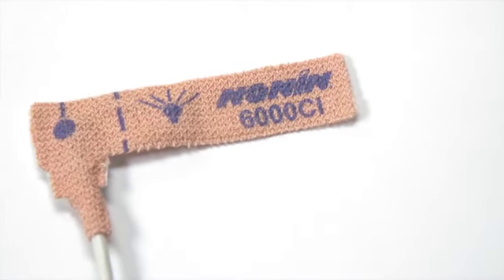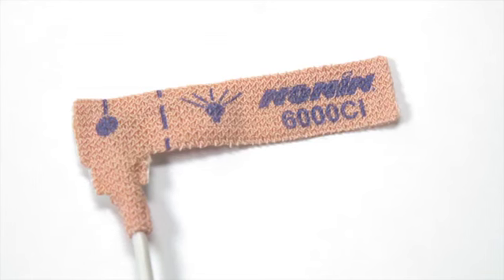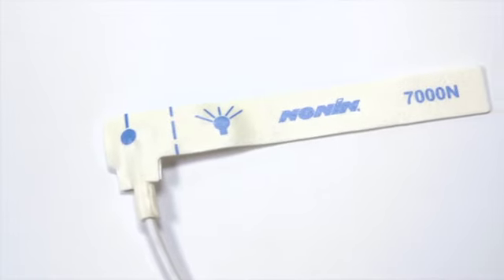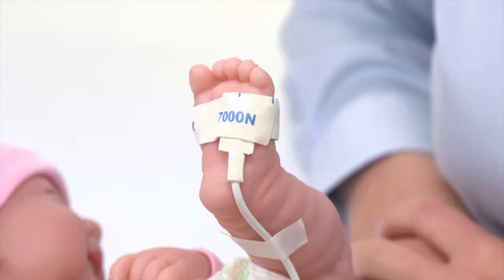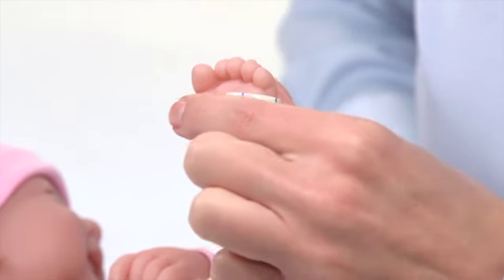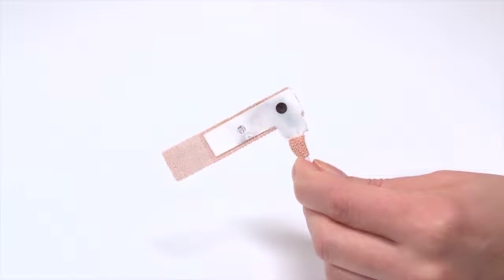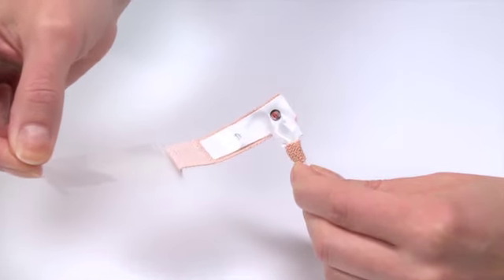Nonin 6000 cloth sensors use cloth material for easy placement and may also be used for frequent repositioning. Nonin Flexiform 3 series use microfoam for additional comfort and secure placement in extended monitoring situations. The soft, cushioning material is comfortable to the application site. For both types, simply remove the adhesive backing so the sensor adhesive is exposed.